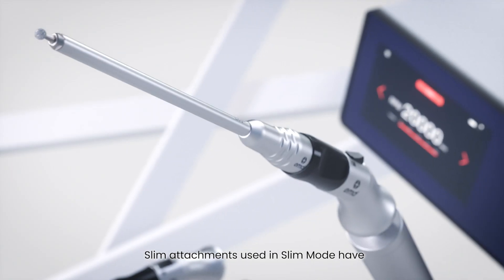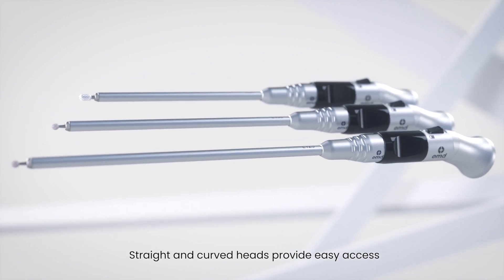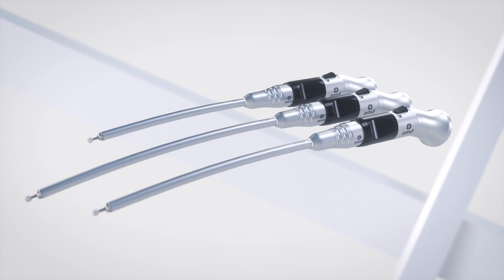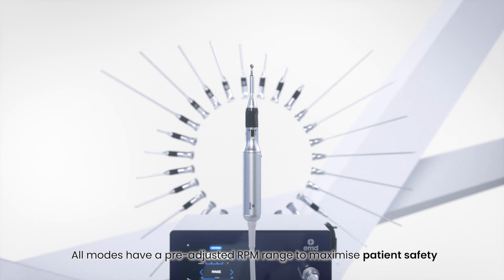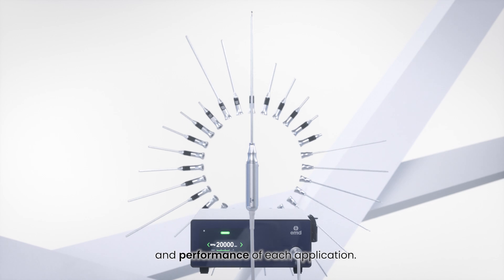Slim attachments used in slim mode have great balance for long-time use. Straight and curved heads provide easy access during head, neck, and ENT surgery. All modes have a pre-adjusted RPM range to maximize patient safety and performance of each application.